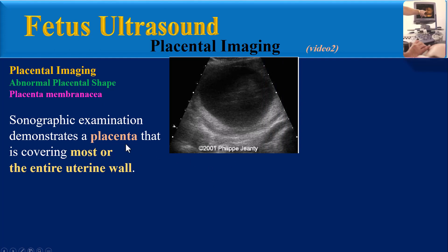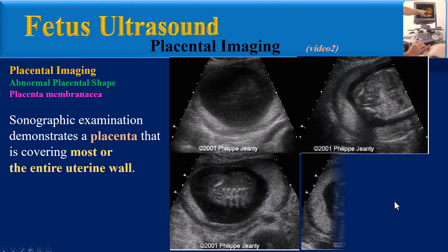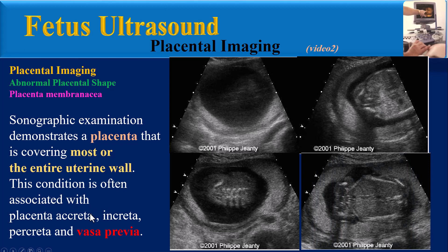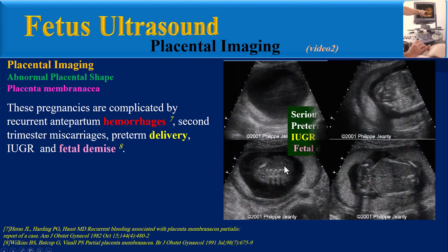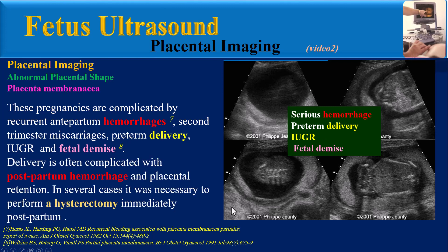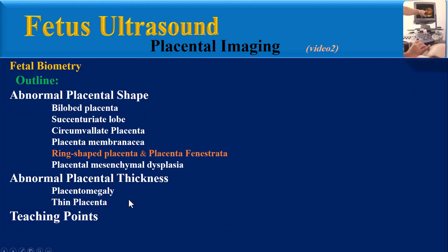With placenta membranacea, all or nearly all of the membranes are covered with villi. Sonographic examination demonstrates a placenta covering most or the entire uterine wall. Images from the fetus.net website show placenta membranacea at the first trimester, early second trimester, late second trimester, and third trimester. This condition is often associated with placenta accreta, increta, or percreta and vasa previa. These pregnancies are complicated by recurrent antepartum hemorrhage, second-trimester miscarriage, preterm delivery, fetal growth restriction, and fetal demise. Delivery is often complicated by postpartum hemorrhage and placental retention; in several cases hysterectomy was necessary immediately postpartum.